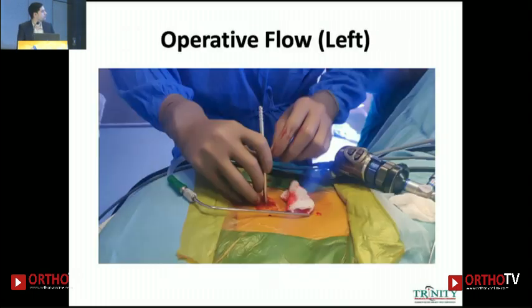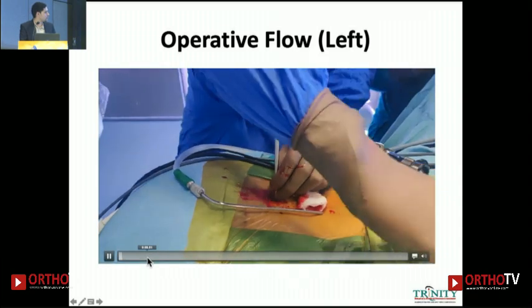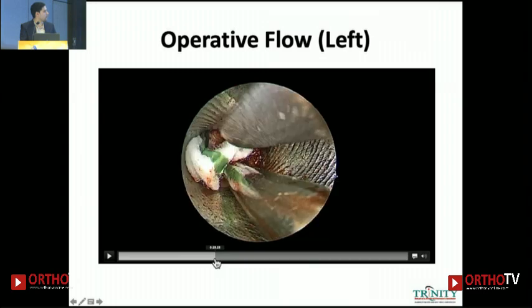So this is an operative video. For the want of time, I hope it plays. So this is how it goes.